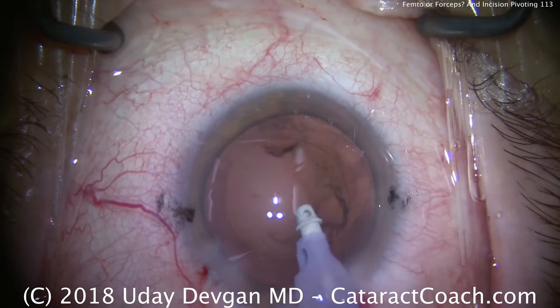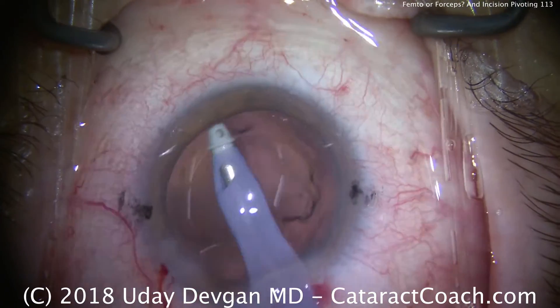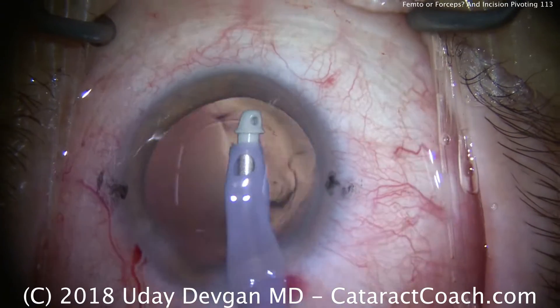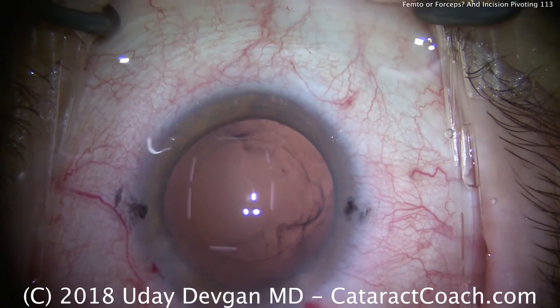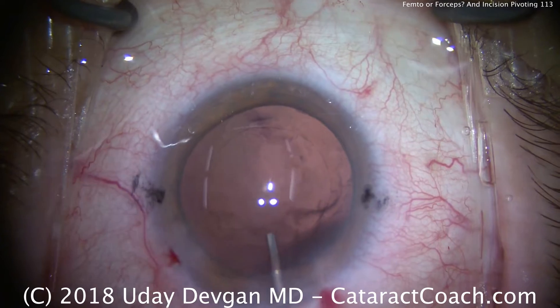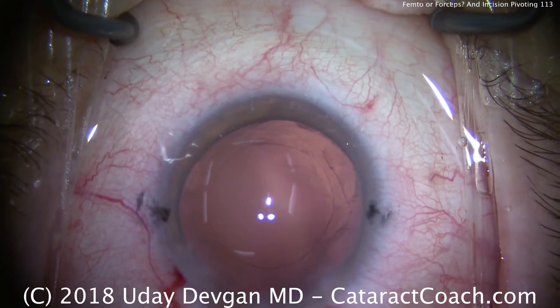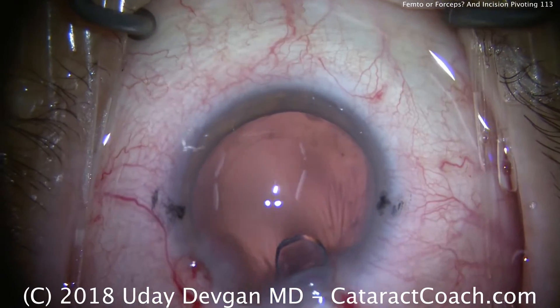There is no need for the half-million-dollar femtosecond laser. Certainly later, after you've learned your first few hundred cataract cases, it's perfectly fine — and even recommended — to try out all new technology you have access to, and then make a critical judgment whether that technology is important for your patients or in your hands. We fill the capsular bag with cohesive viscoelastic. We can see there's a nice round rhexis, and now we're going to deliver our lens — a single-piece acrylic lens going into the capsular bag.